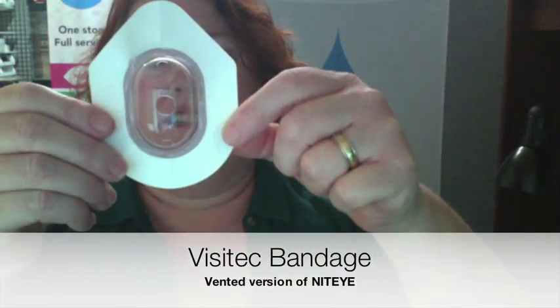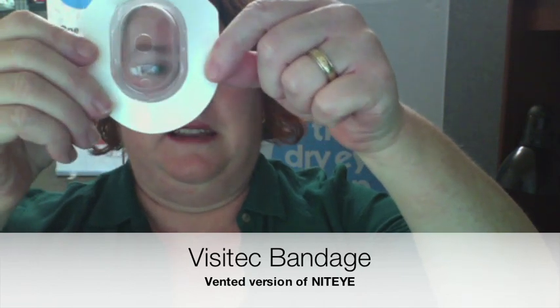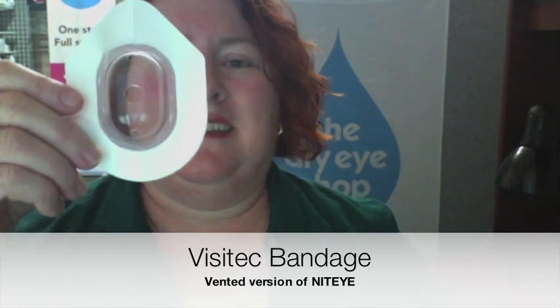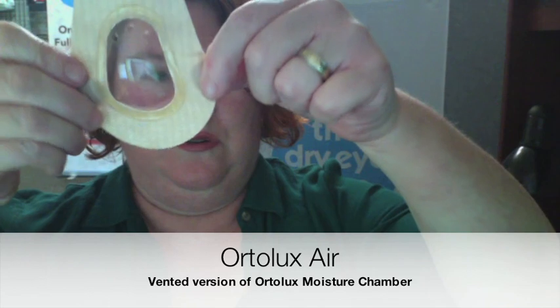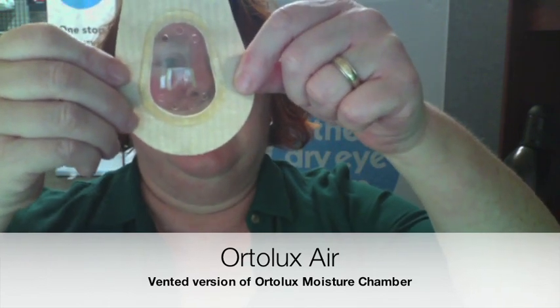Then we've got the vented ones. The vented version of the Night Eye is called a Visitec eye bandage — you can see it's got little holes on either end and then a big one in the middle. No good for dry eye, but if the doctor does not want them completely sealed in, it might at least give some protection from a fan. The vented version of the Ortolux is the Ortolux Air — it's got little holes just at the ends, nothing in the middle. For vented protection that still blocks most moving air from a fan, this one would probably be a better bet.